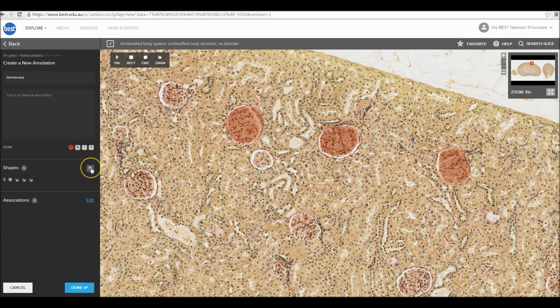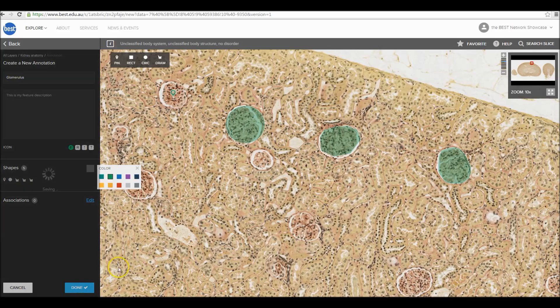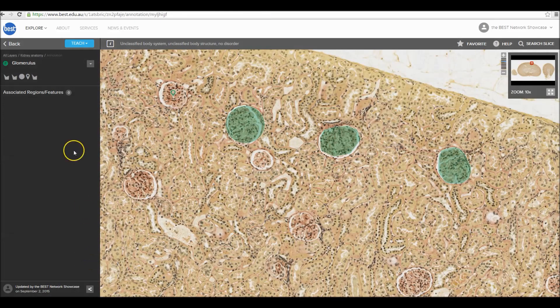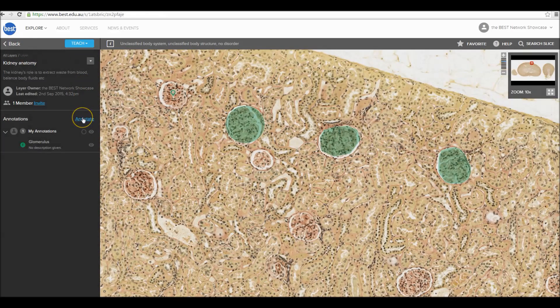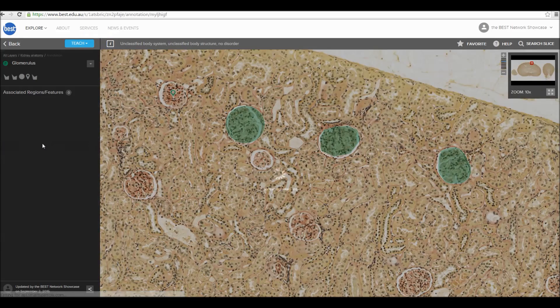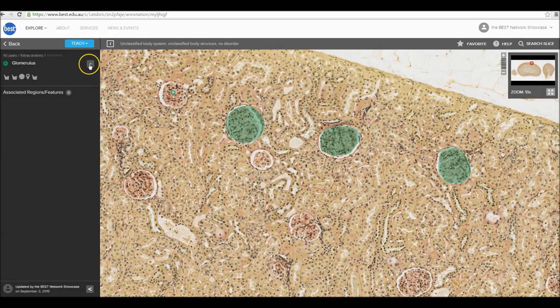You can change the colour of the annotation so that it stands out against your image. Click Done and return to the home page. To annotate a new feature, simply click Back and click Annotate.